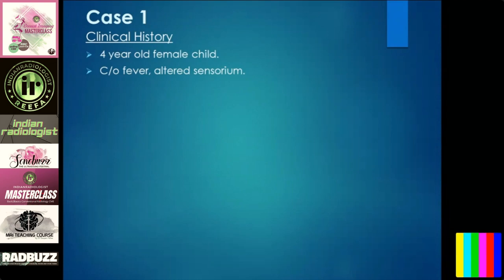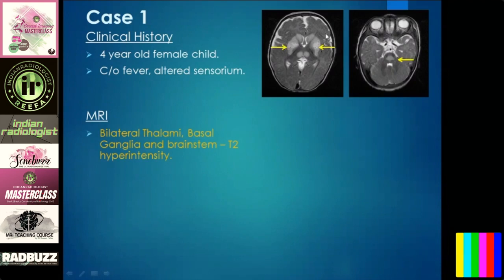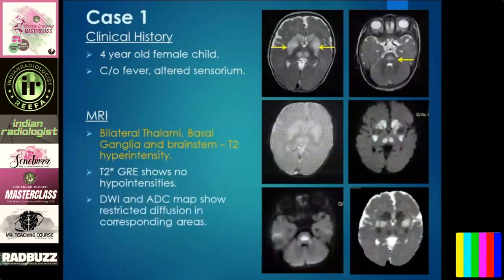Case one: a four-year-old female with fever and altered sensorium. The images show bilateral thalamic and basal ganglia and brainstem T2 hyperintensity. There was no hypointensity on GRE. On diffusion-weighted imaging, the ADC showed restricted diffusion.